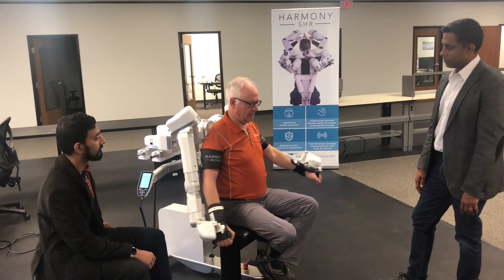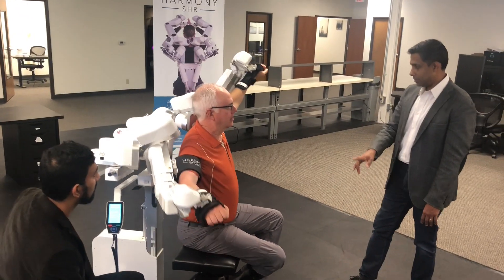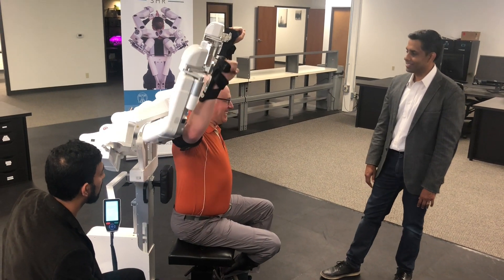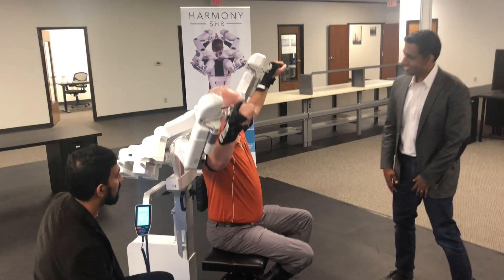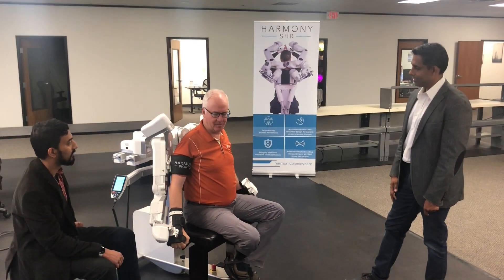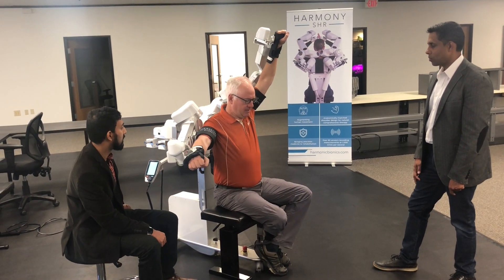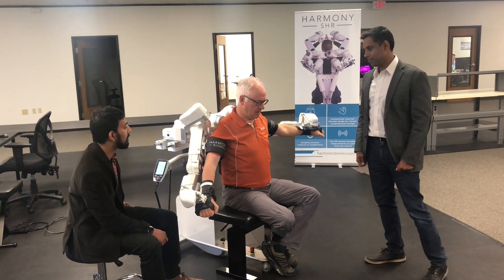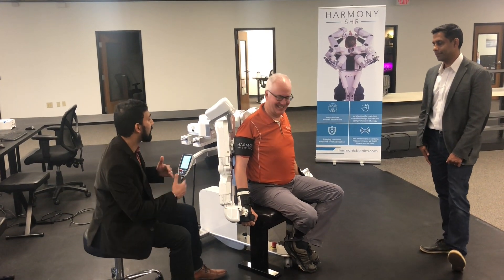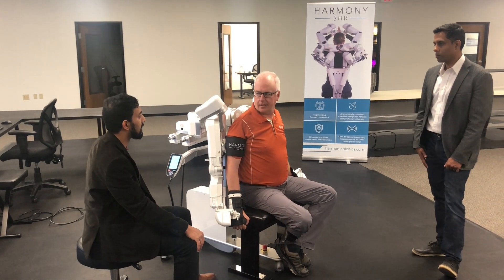He could have done it that way, but we did not want to, because otherwise... if you don't put in zero effort, that's what is happening. And if you put in effort — awesome. So it's maybe 50%? In mirror mode it's dialed to about 50. What we did, just for safety in our first release, we've capped how much it can assist. And then with the next software update, we're actually going to allow it to do more and more — just being safe, being conservative.